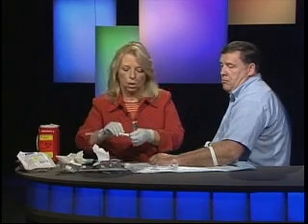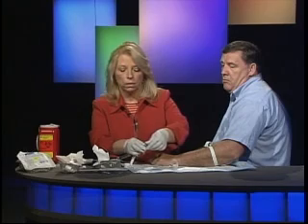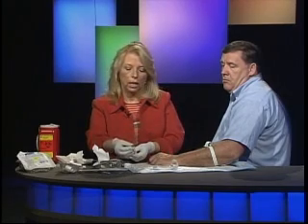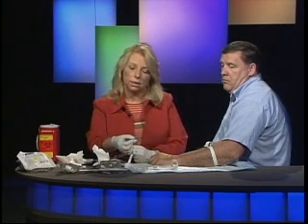flush my catheter to make sure that my catheter is patent, to make sure that I have no defects in my product, because I don't want to insert a catheter that may be compromised before I get it into the vein. I know my catheter is ready to roll. Again, I'm prepared with this particular product. I have pinched the wings to stabilize my stylet, and now I'm going to tell the patient that I'm ready.